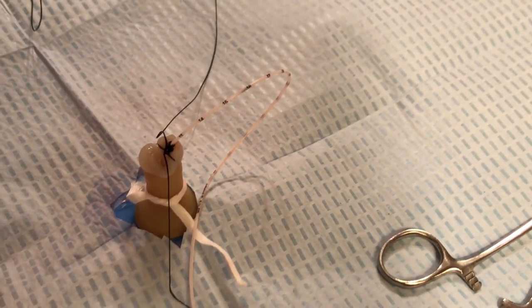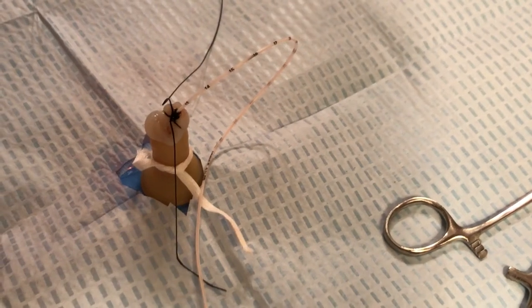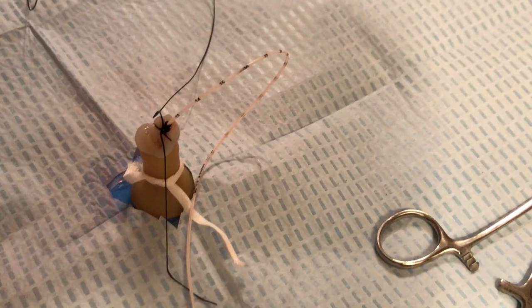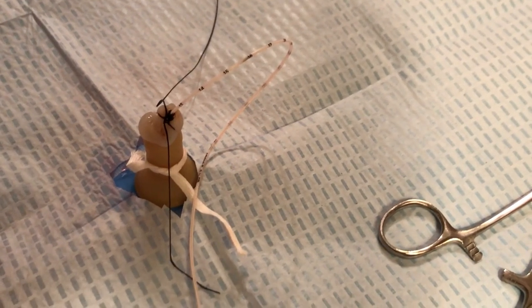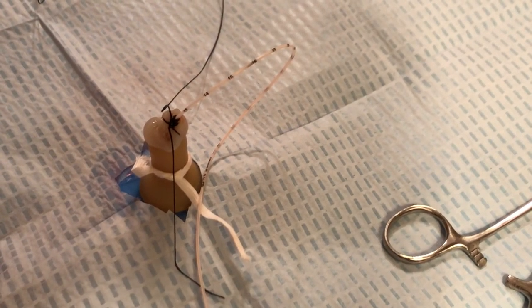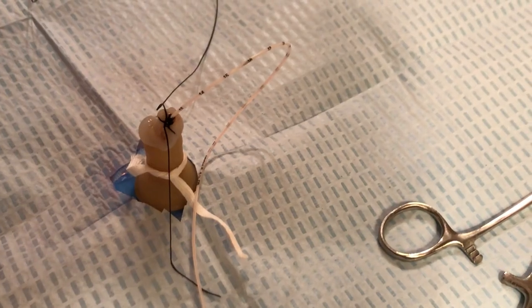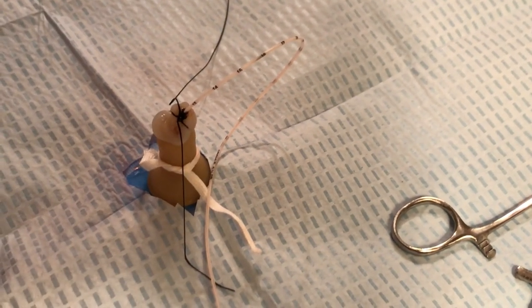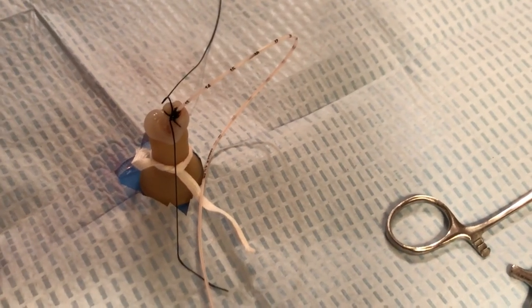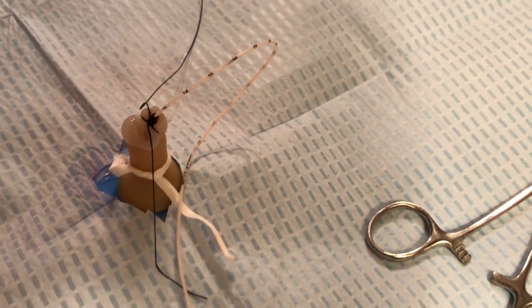Once you exit the sterile field, it's imperative to remind the nurses to create the bridge taping, or goalpost taping, to add securement to the umbilical catheter. As a final reminder, infants who have umbilical catheters in place should be positioned supine for direct visibility of the umbilicus — therefore no snuggies, blankets, or diapers should be covering the umbilicus.